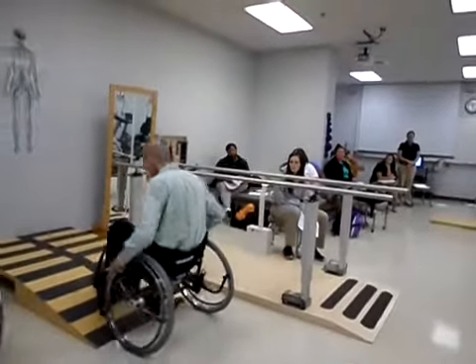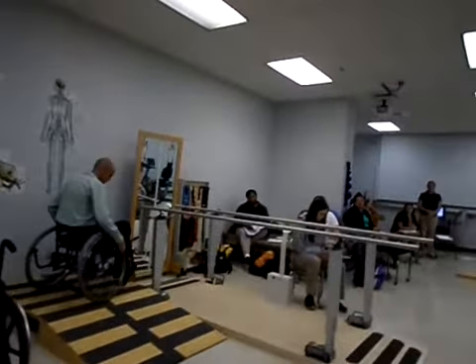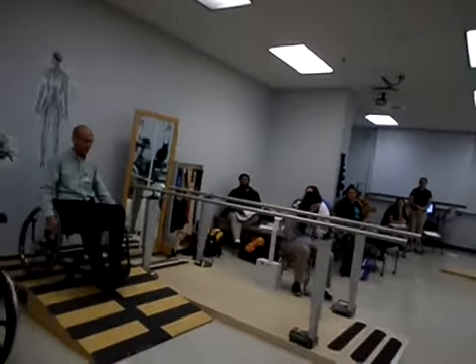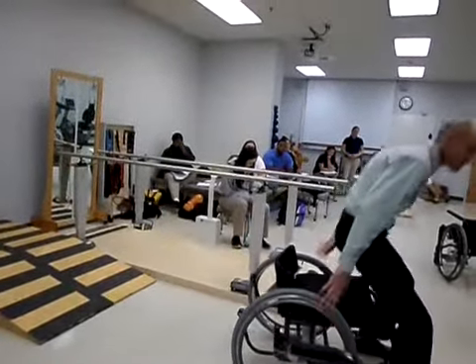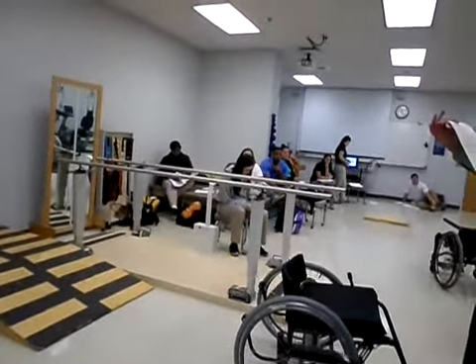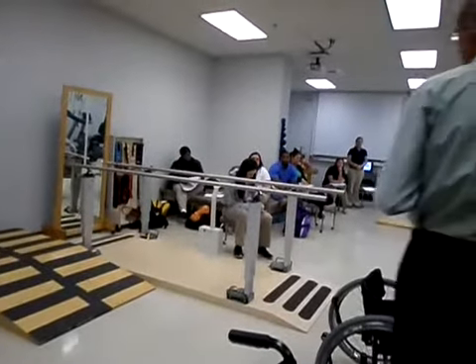Okay, so one more time. Really, that was too loud. Lean forward. Make sure you're leaning forward as you're going up. Be careful turning at the top, and then lean backwards as you go down. Use your hands as a brake. I think that might be it. Okay. Any questions? You're going to be in your same groups of 4 or 5.